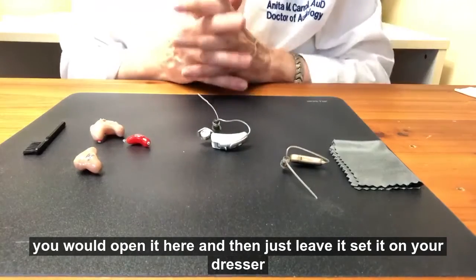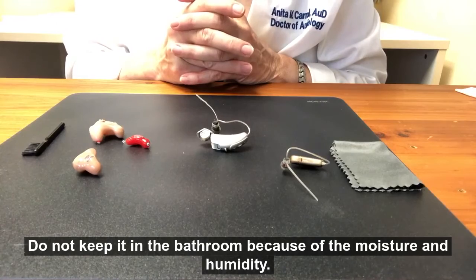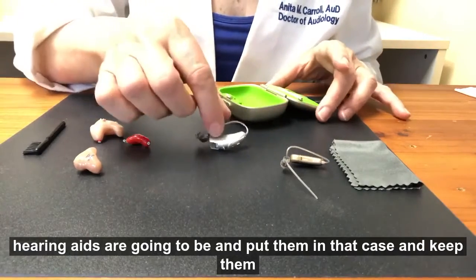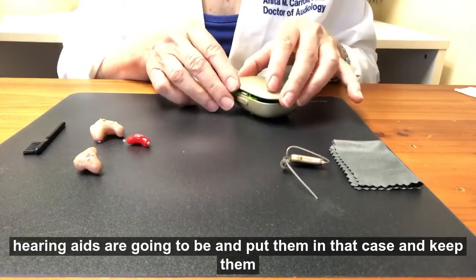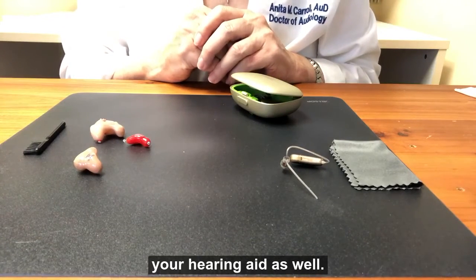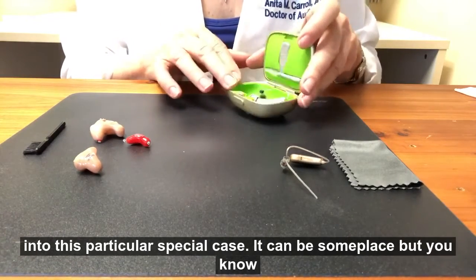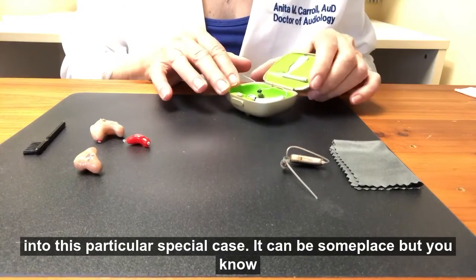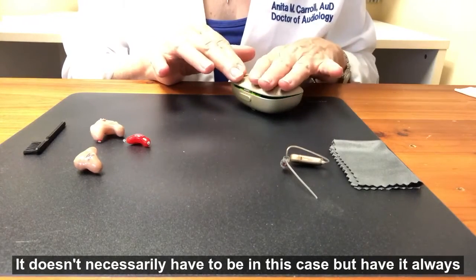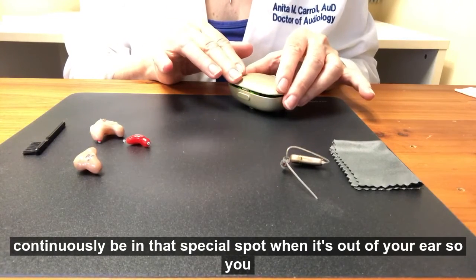Just leave it — set it on your dresser or your nightstand. Do not keep it in the bathroom because of the moisture and humidity. I always advise keeping a special case so you know where your hearing aids are going to be. Put them in that case and keep them there until the next morning. That will prevent loss of your hearing aid. Every time you take your hearing aid out of your ear, it should go into that special case — someplace you would only keep the hearing aid — so you won't lose it.